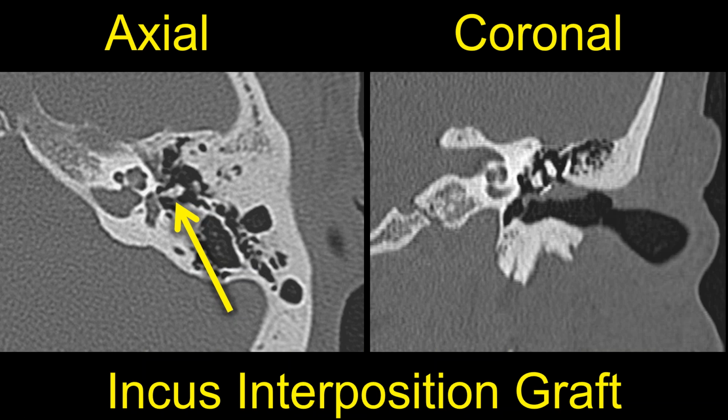If you're not at a place where you see a lot of neurotology work, you may not see these cases very frequently, but just so you understand what these different plasties are. This is an example of a plasty where we may not be putting man-made structures in and replacing the ossicular chain. We're trying to use the ossicular chain itself and repositioning the incus to form that bond between the malleus and the stapes.